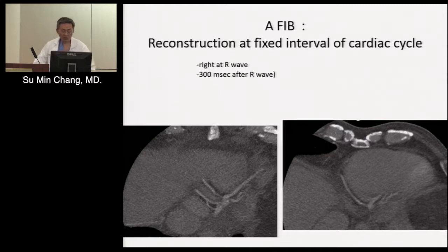Okay, atrial fibrillation used to be a contraindication for coronary imaging. It's no longer, I think, let's put it this way. There are still cases where it's probably not appropriate to do coronary imaging with AFib. But if it's someone with AFib, unless the heart rate is over 120, 130 and very, very irregular, most of the time with our new scanner, we can get a diagnostic study. It might not have exactly the same diagnostic accuracy as in someone with perfectly normal sinus rhythm.